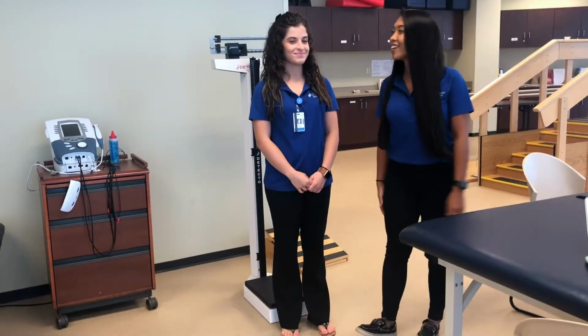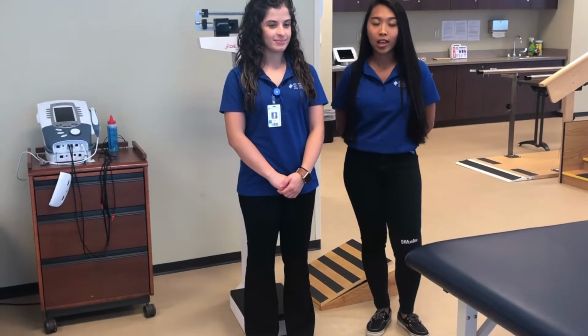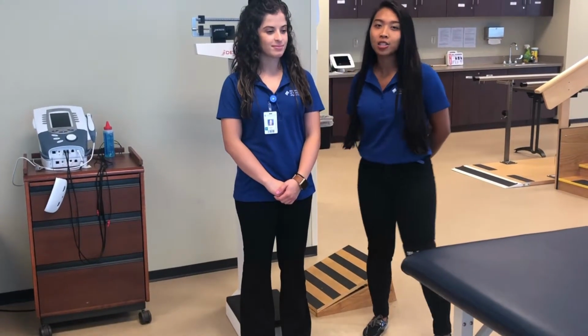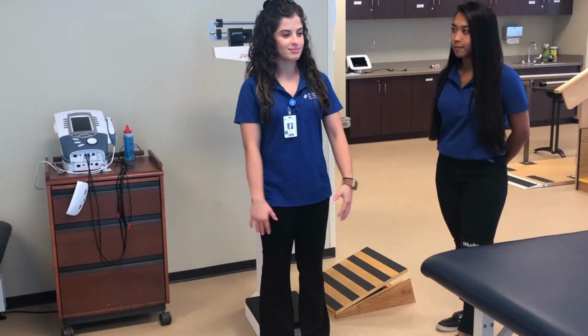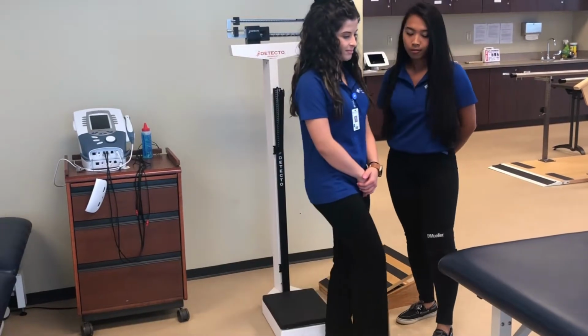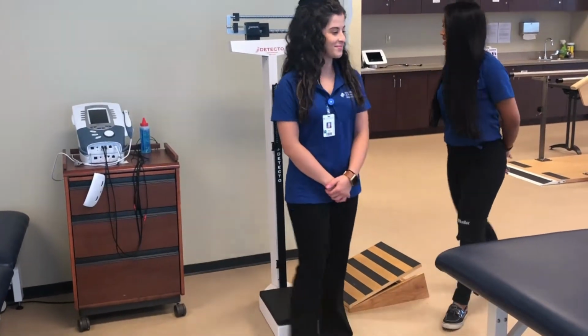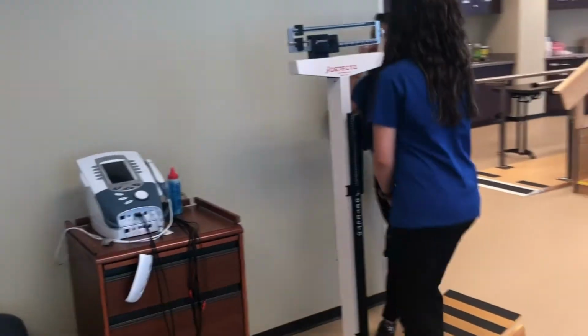This is Ariana, and today we're going to be taking her BMI, which consists of her height and weight. So the first step is to ask your patient to please take everything out of their pockets. Good? Okay, now I'm going to ask her to please take her shoes off. Perfect. And now I'm going to have her stand on the scale facing the wall.